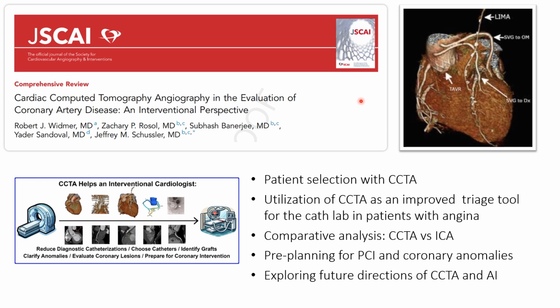Here's an example of somebody who has very complex coronary anatomy. They've had multiple bypasses that you can see that are patent. So CT can tell you what your bypass situation is, even if you don't have an op note. And if you're interested in this, you can certainly look it up at JSCAI.